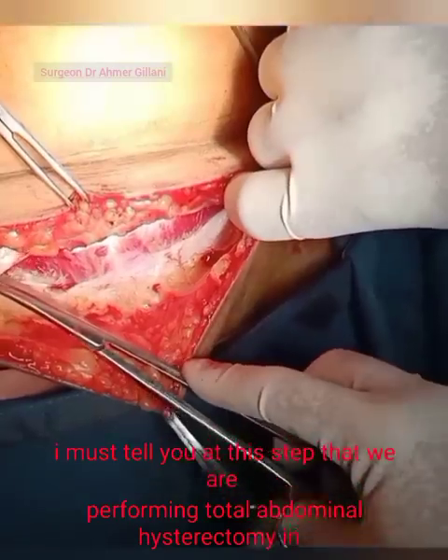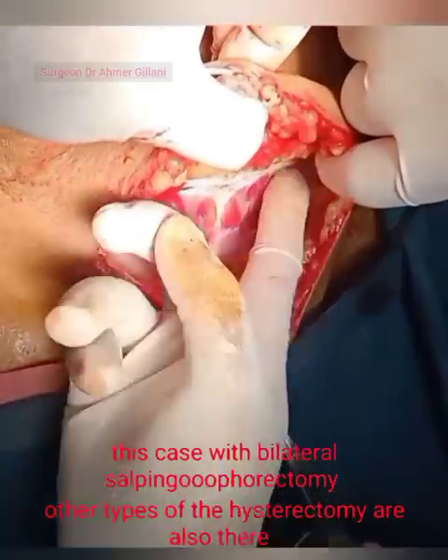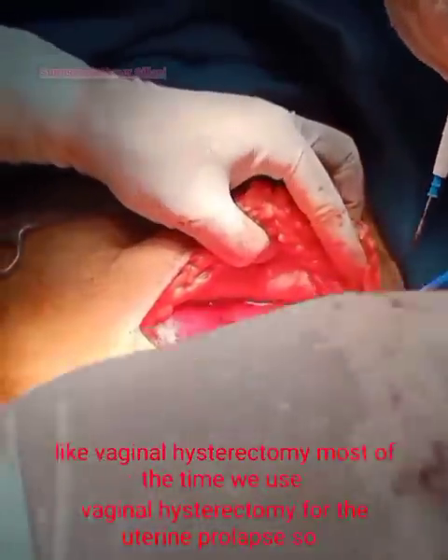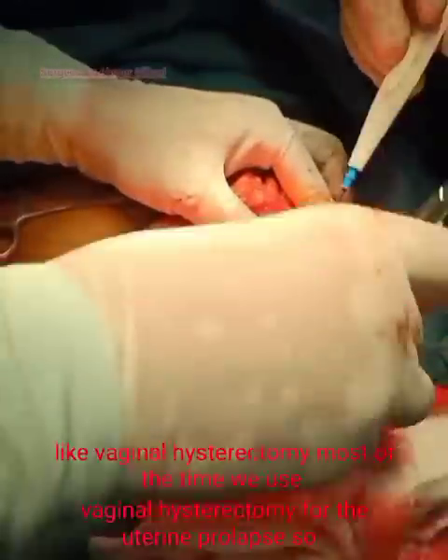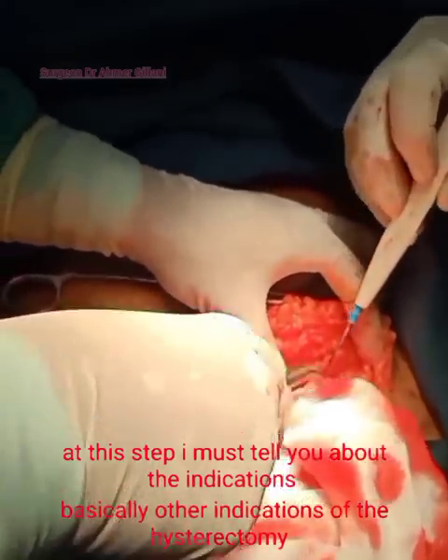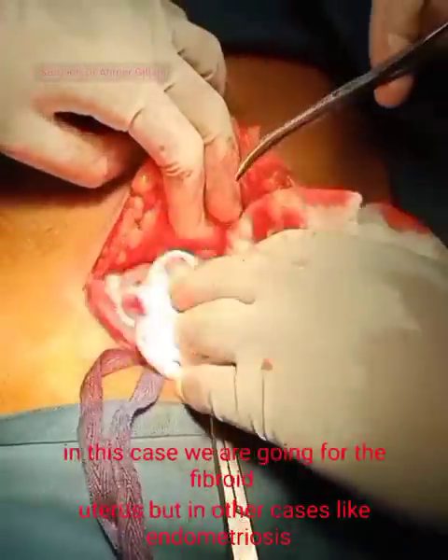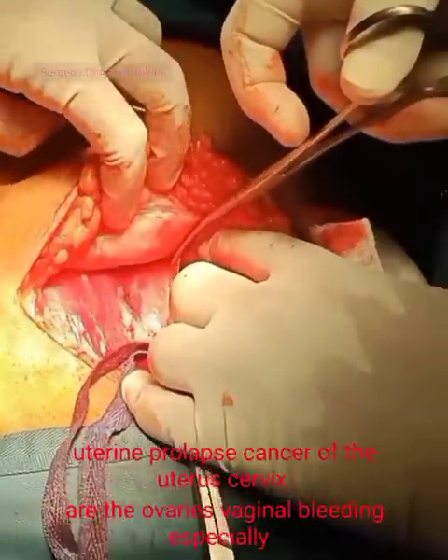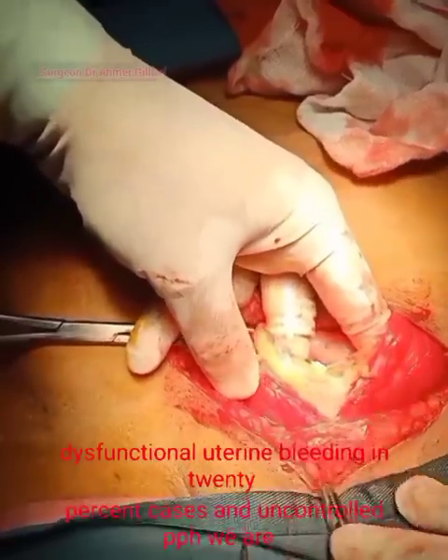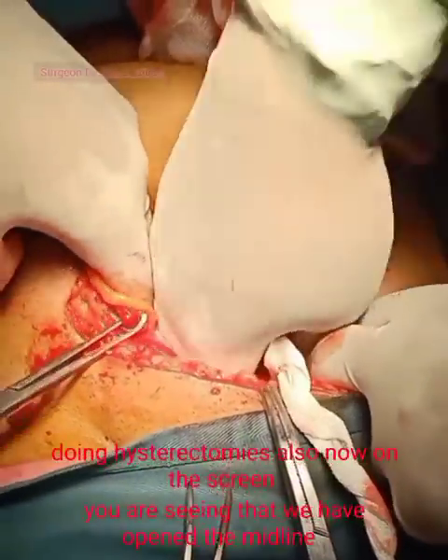At this step, we are performing a total abdominal hysterectomy with bilateral salpingo-oophorectomy. Other types include vaginal hysterectomy, most commonly used for uterine prolapse. Indications for hysterectomy include fibroid uterus, endometriosis, uterine prolapse, cancer of the uterus, cervix or ovaries, dysfunctional uterine bleeding in about 20% of cases, and uncontrolled postpartum hemorrhage.